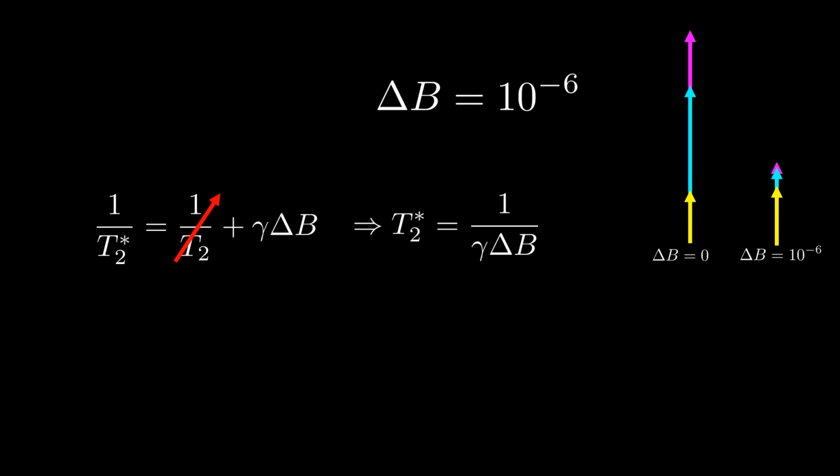And this part per million example I keep using does indeed reflect most commercial MR scanner limits. Manufacturers boast field homogeneity about 1 part per million within the volume of the scanner bore. Of course, field homogeneity gets better as you image a smaller and smaller volume. Fields can be 10 to 100 parts per billion if your field of view is down to tens of centimeters, which is quite impressive, but of course is a large percentage of a scanner's price tag.